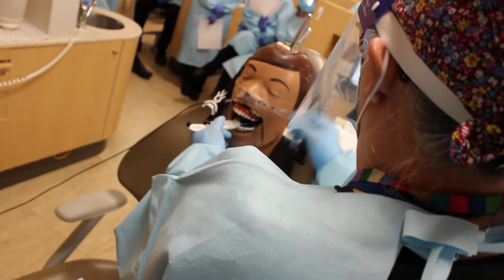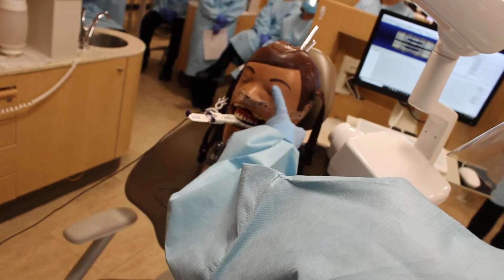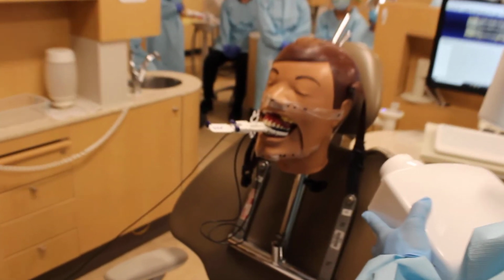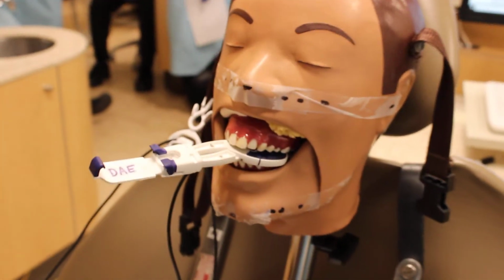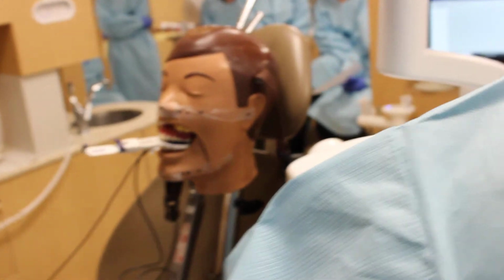So we're going to go a little further forward for the premolar. So now we're going to do the inner canthus of the eye. So it's the second dot. What's the angulation, someone? Negative 10. Okay, so it's about the same. Pass that down so somebody else can see what you're reading yourself. I'm going to do the second dot.